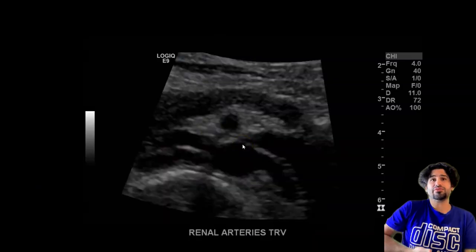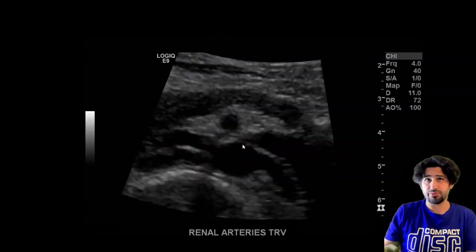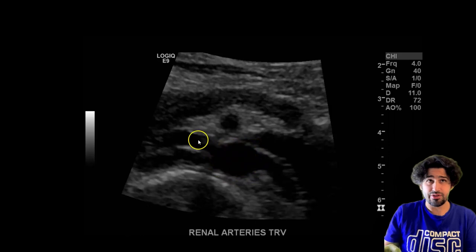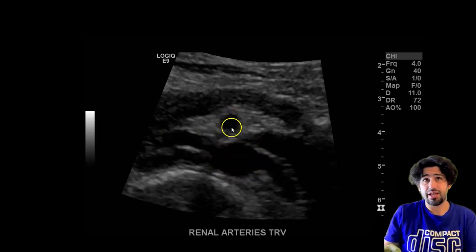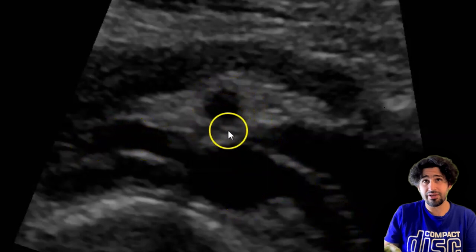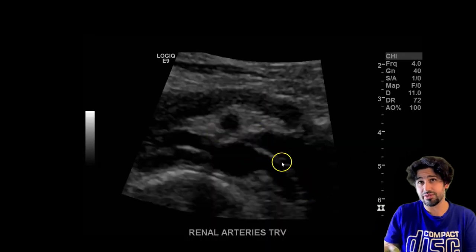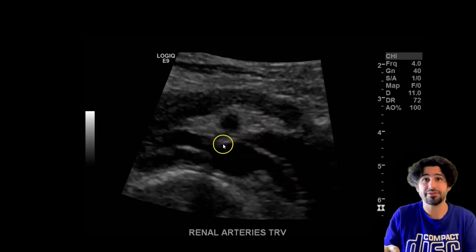Here's one I did in transverse right below the epigastrium. You can see the aorta here, the right renal artery, left renal artery, and SMA. Look at how small the left renal vein looks there, and then you can see how it gets wider as it goes away from this section.